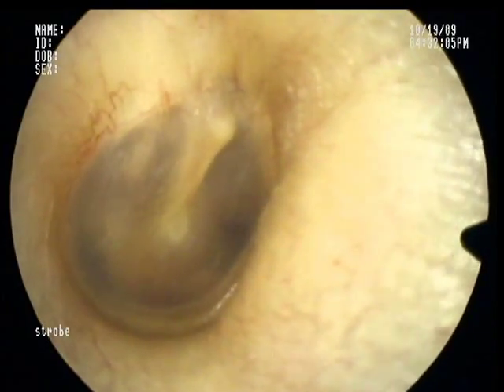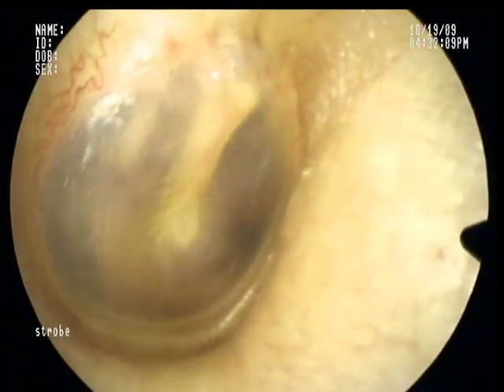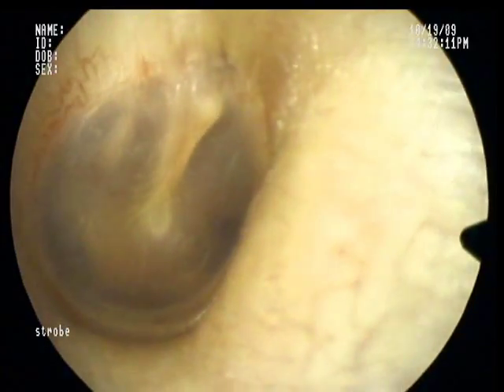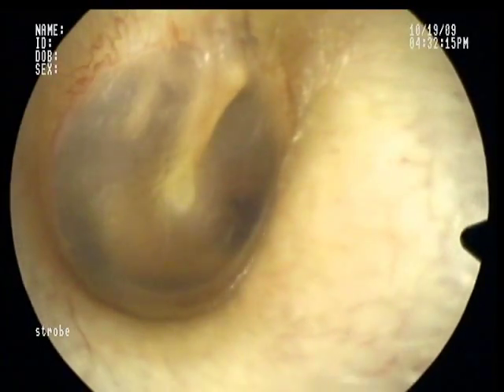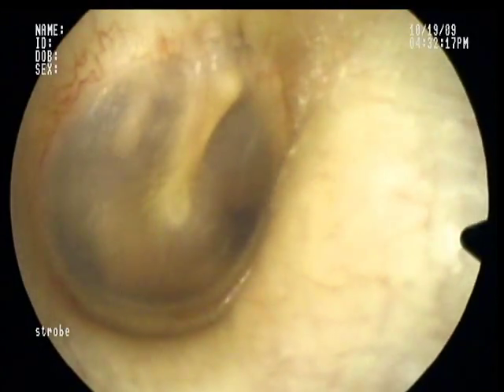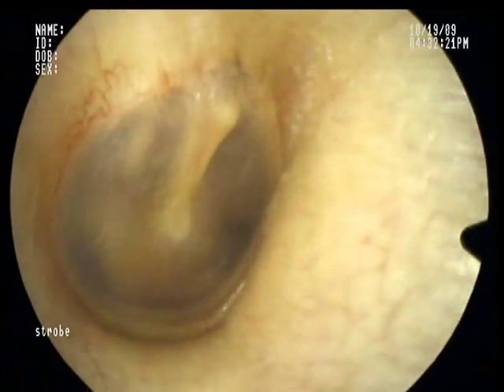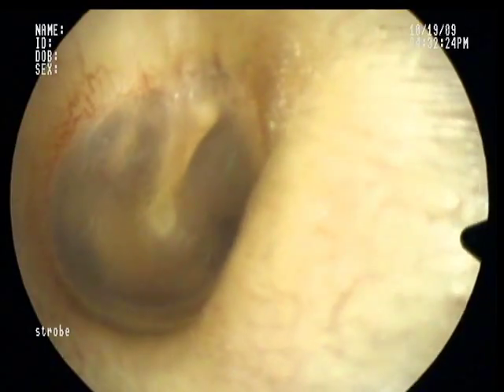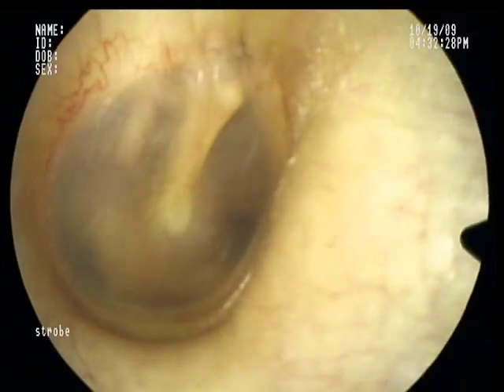Now I'm going to auto-insufflate my eardrum here — watch carefully. That's me actually popping my ears, or forcing air into my eustachian tube to open and equalize the pressure within my middle ear space. So that's what happens every time you create pressure against that closed glottis.